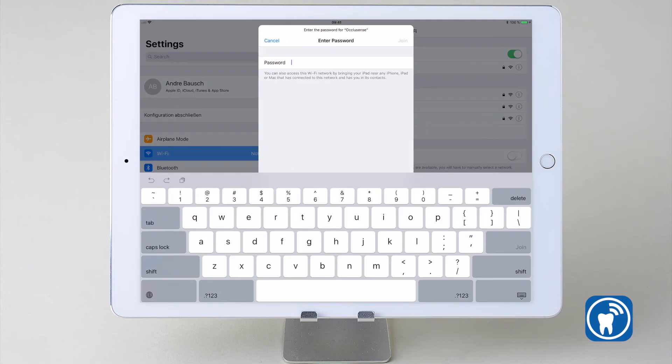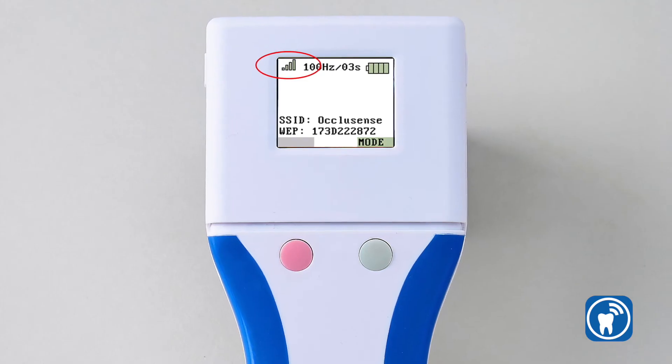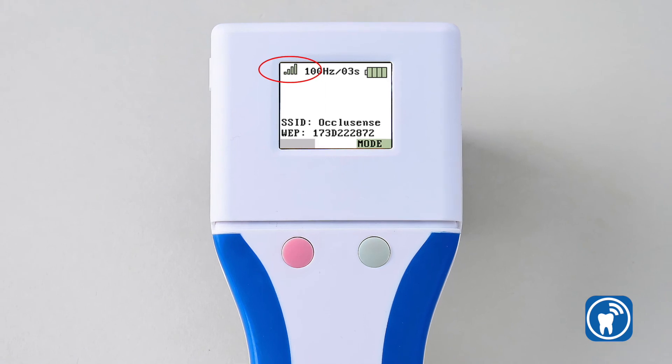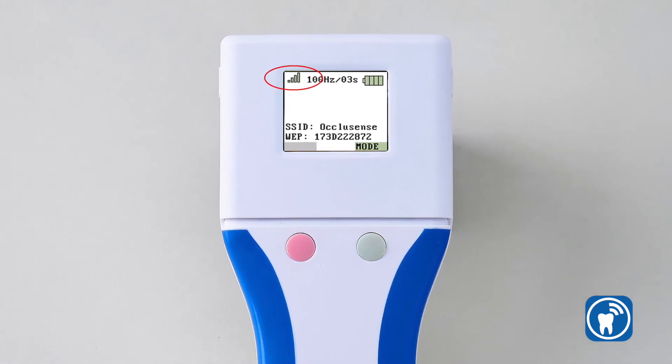Select the Oculusense network and enter the password, which is shown on the display of your handheld. Once the connection has been established successfully, it is indicated by color status bars on the display of your handheld.